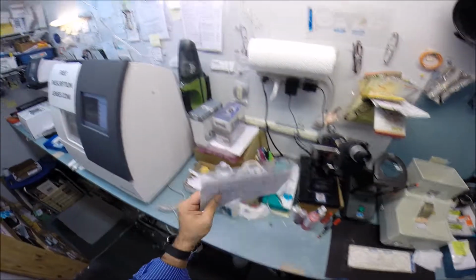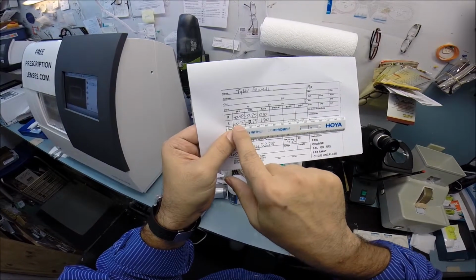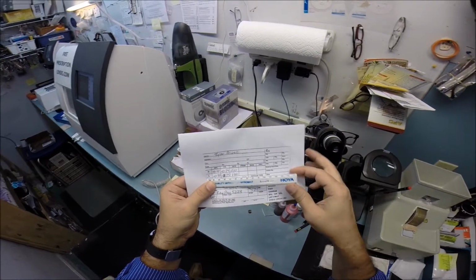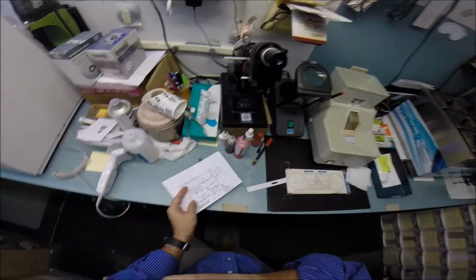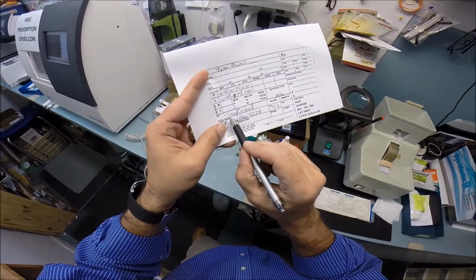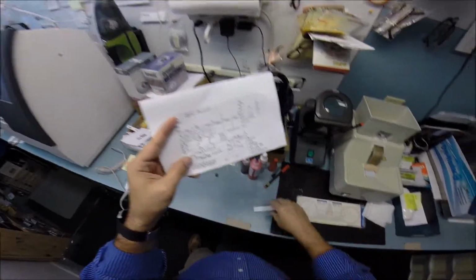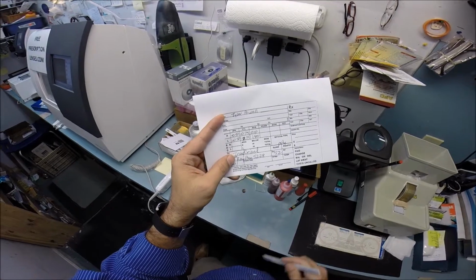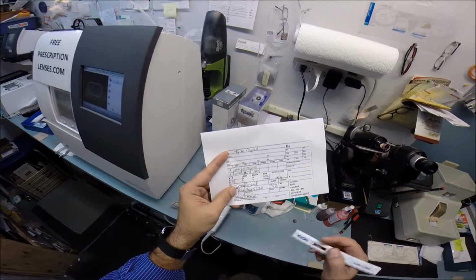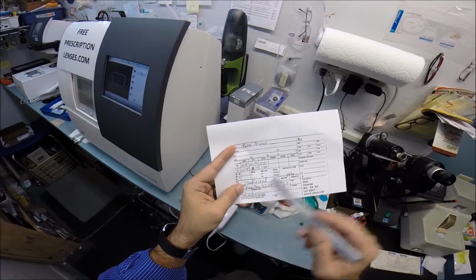The reason why I get that, your right eye reads -.50, -.75 at 10. The left eye reads -.50, -.75 at 180. The unit of measurement we use in the optical world, and you know what? Even though this isn't a permanent copy, I'm just going to write on there, these are Transitions 7 lenses with Crizal anti-glare coating. But you need the unit of measurement, again, the diopter, starting at 0, being plano, better known as non-prescription. Starts at 0, goes up from there, 0.25, 0.50, 0.75, 1, 1 1/4, 1.50 on up.